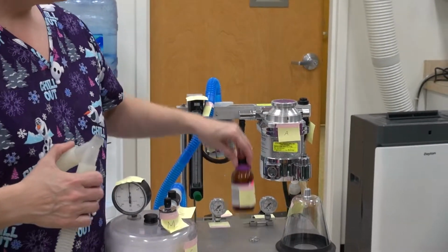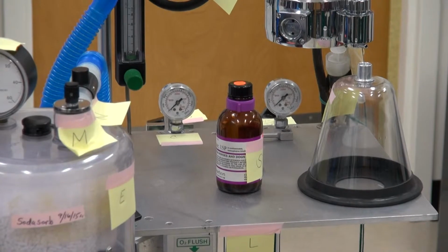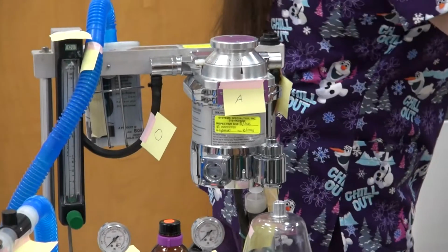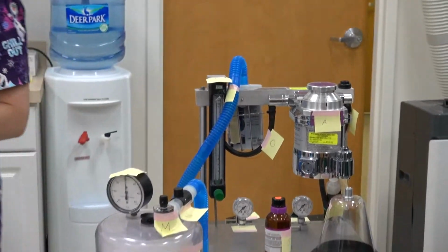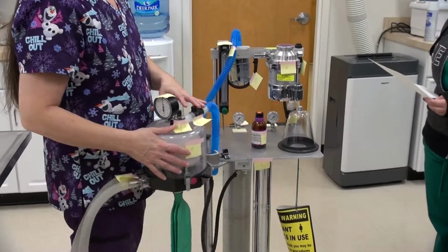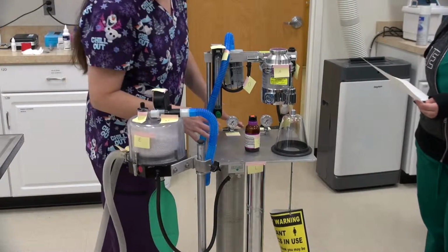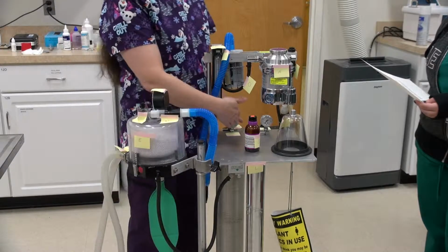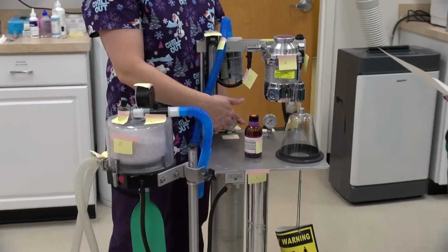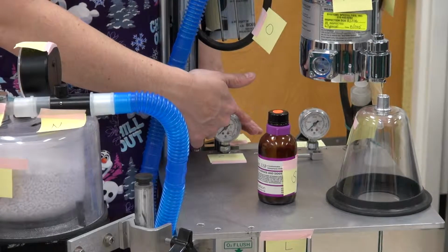And then what is S? Liquid isoflurane. And it obviously turns into what in our machine? Vapor, right. Okay, so for the checklist that I gave you, and you guys need to know this, because this will be part of it, number 1, you want to check all your oxygen levels before you start operating your machine, correct? So what are we looking for on our machine? The pressure. Above 500 PSI. Right, we're looking to make sure this is above 500 PSI. If it's below, we need to change our tank.